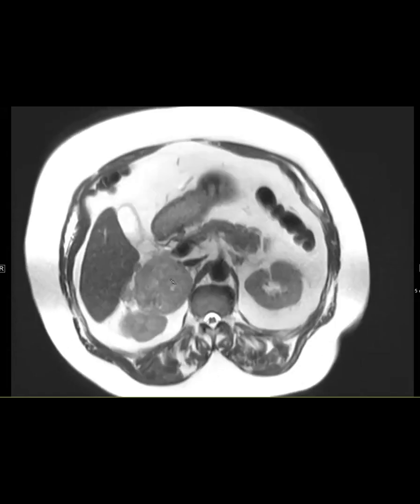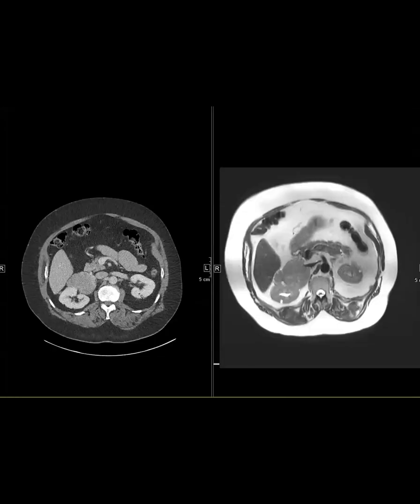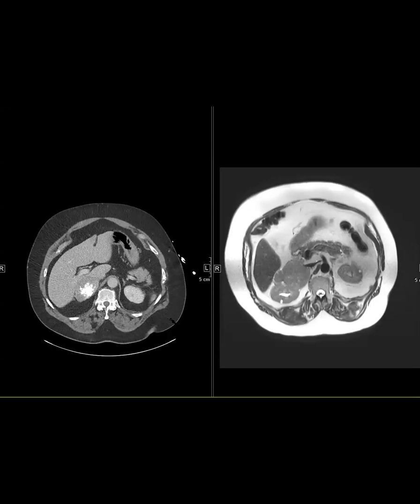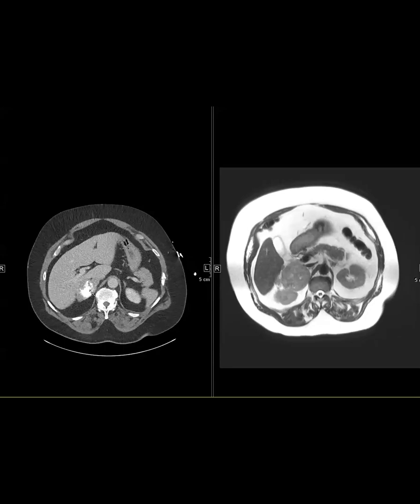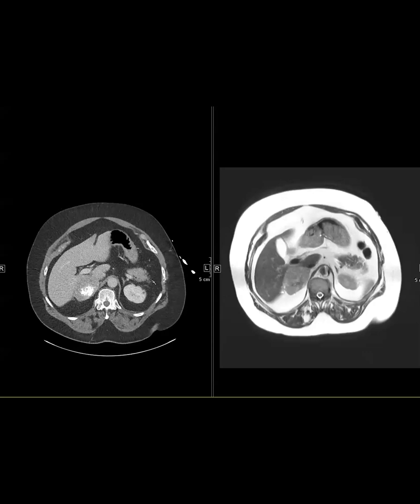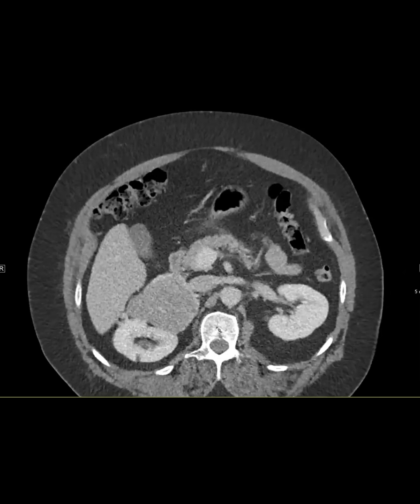And the other reason is that it looked like maybe it was growing along veins. And then the other big reason was because of this calcification here. So you can get calcifications in both, but they're much more common in adrenal cortical carcinoma. So anyway, this was biopsied and it was an ACC. One other thing about ACC: they much more commonly have calcification than a pheo. And another thing is, don't get deterred by the hypertension, because they can be hypercortisol producing and also give you metabolic syndrome and hypertension.